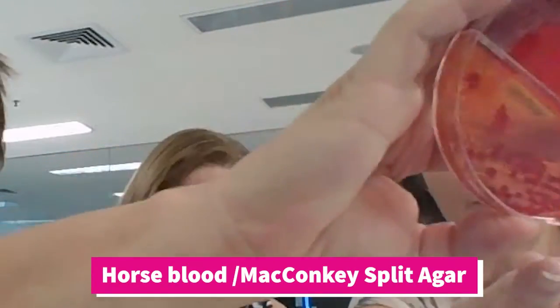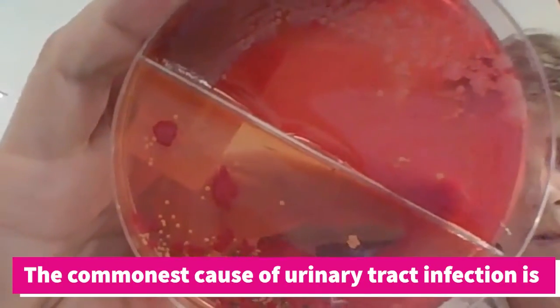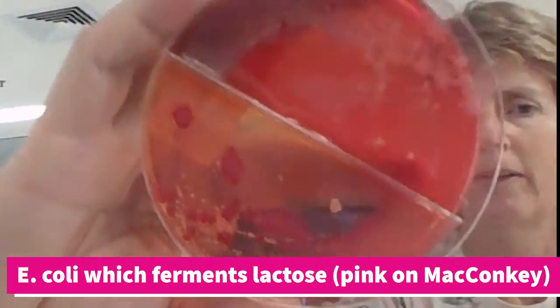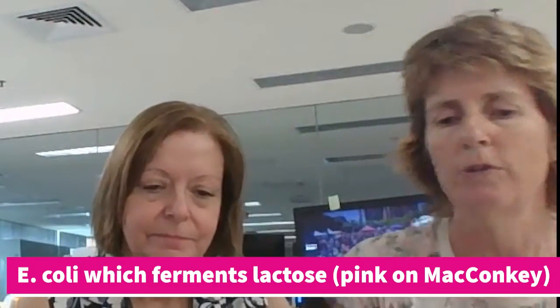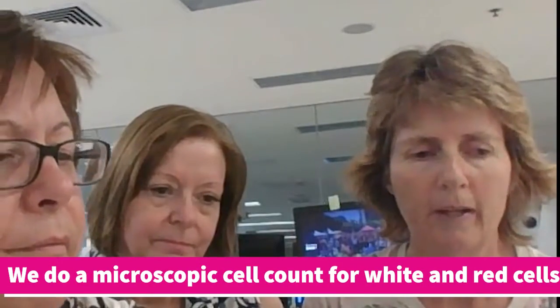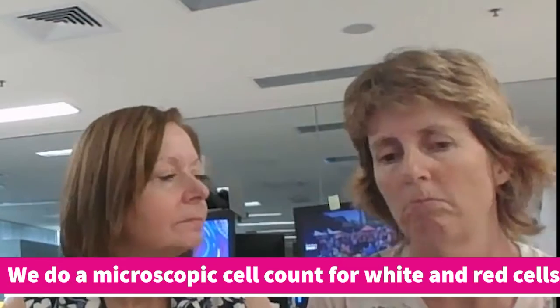And on this side of the plate, our organism, which is the most common cause of urinary tract infection, E. coli, actually goes this beautiful pink colour, and that's called lactose fermentation. And like I said, that's the most common cause of a urinary tract infection. With our urines as well, we do a cell count to see if there is an infection, and usually more than 100 cells is a significant count. We count white cells, red cells, epithelial cells.